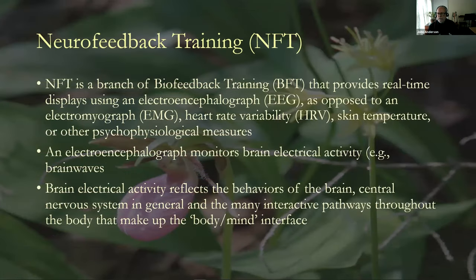Neurofeedback training is a component of biofeedback training. Neurofeedback training provides real-time displays of electroencephalography, the EEG, the electrical activity from the brain. And that's opposed to EMG, electromyograph, for muscle activity, heart rate variability, skin temperature, other physiological measures. All of those are very useful, and neurofeedback is a part of that environment of physiological measures and feedback.